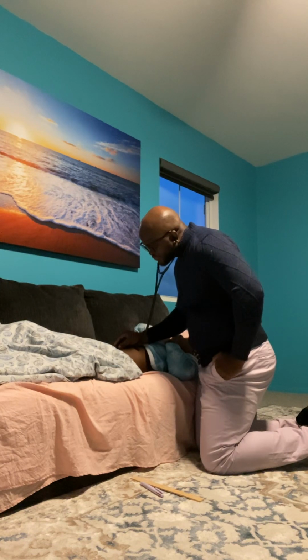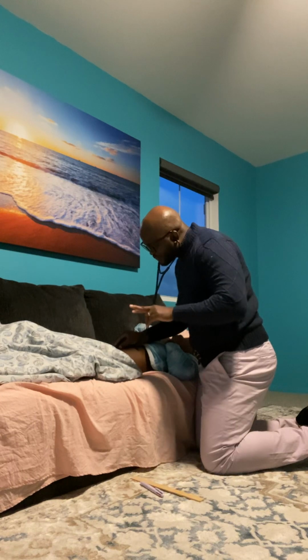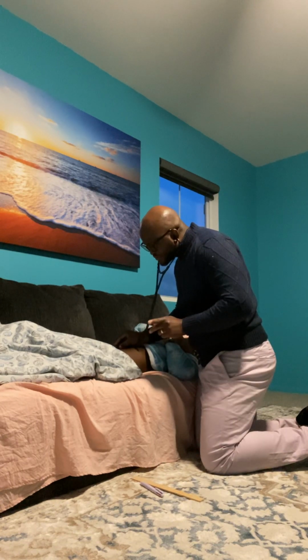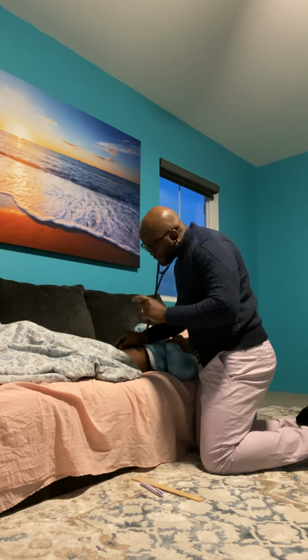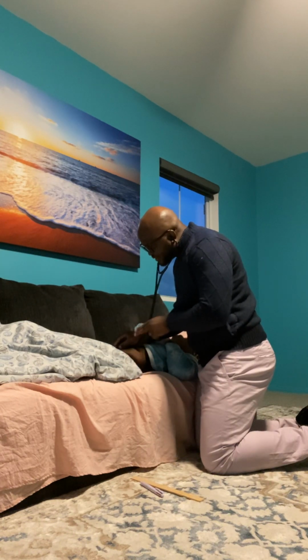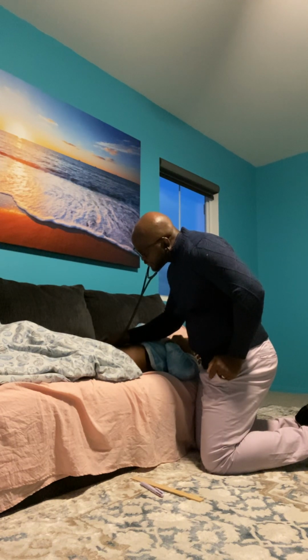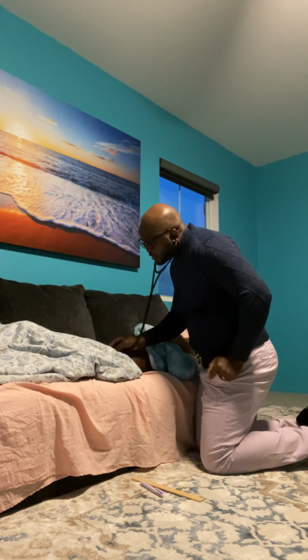And my stethoscope is a high quality one. It doesn't have a bell and diaphragm, so it's just more amplified. If I had the other one, I'd listen with both the diaphragm and the bell. And then from the iliac arteries, you go down below the pubic symphysis line, and that's your femoral arteries. And you listen to both sides bilaterally.